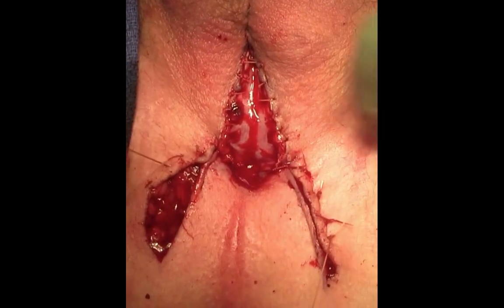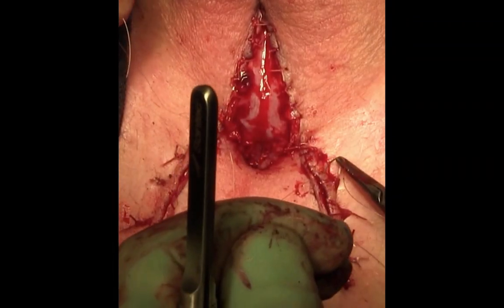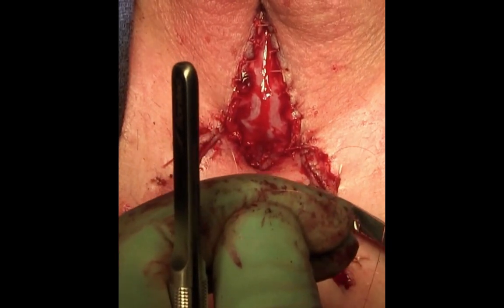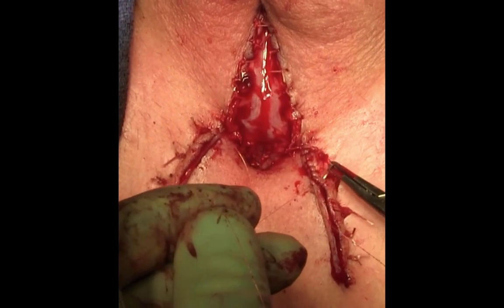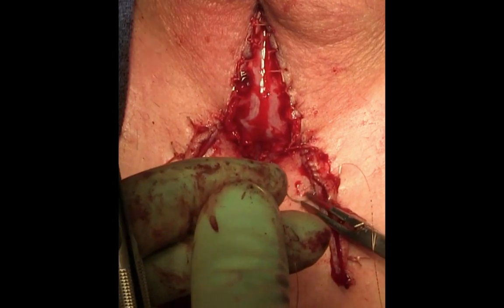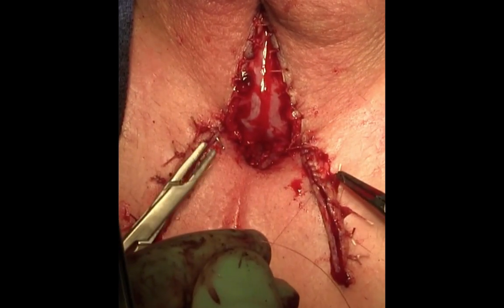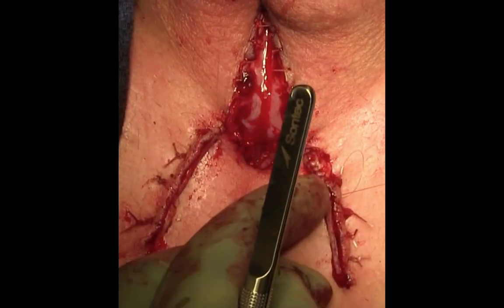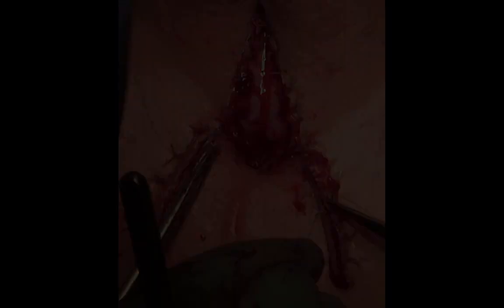Not too much tension should be placed on these sutures, just enough to bring the skin edges together. And then, very precisely, the skin edges are approximated with running 5-0 Monocryl sutures. This encourages very good healing within the area. Wound breakdown can still occur along these lateral incisions, but the combination of horizontal mattress sutures, along with a very fine closure with 5-0 Monocryl, has had the best results in our experience.